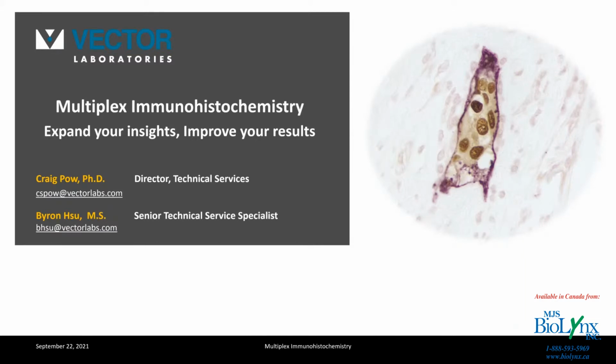It certainly looks like these estrogen receptor positive cells, or cancer cells, are metastasizing from a primary tumor through these lymphatic vessels. This image is a great example. To me, it's the epitome of immunohistochemistry and such a powerful technique to provide this type of insight in certain disease states. We hope that with the information we cover today, you'll be able to generate similar compelling data in your given field of research.